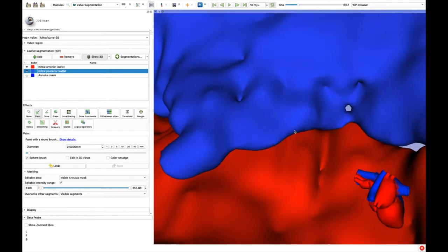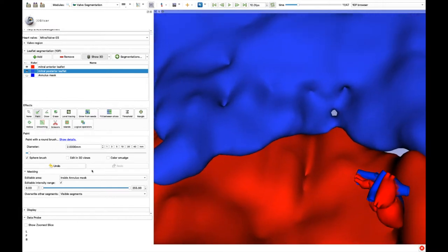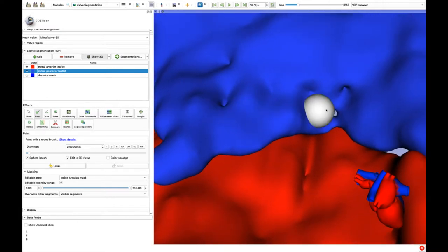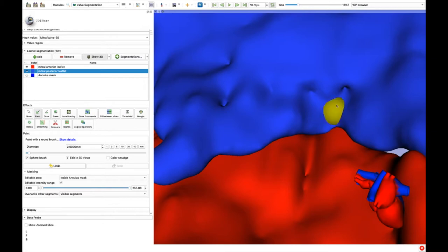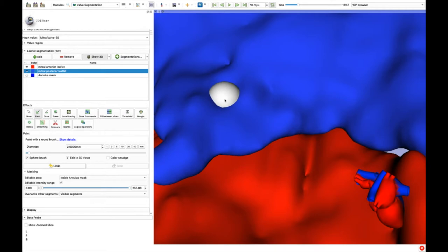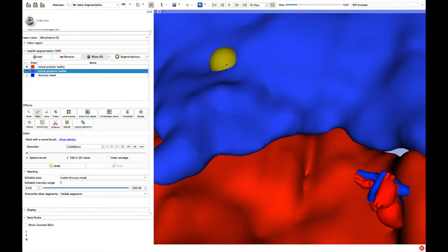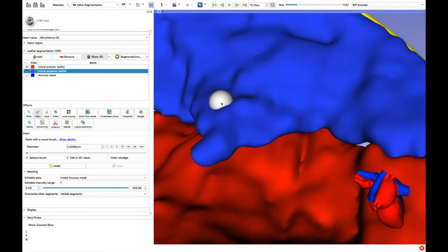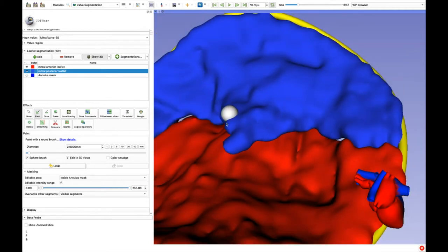By clicking on Enable 3D Editing we can paint directly on the 3D model. We suggest not to overuse this option because while it is useful to fill small gaps, it can at the same time lead to massive errors.